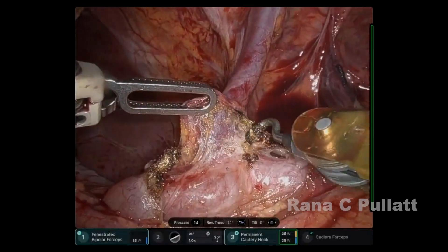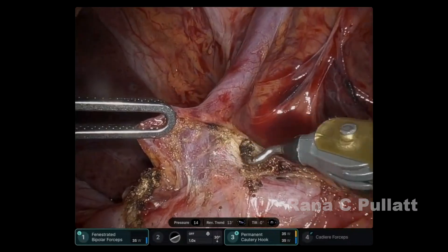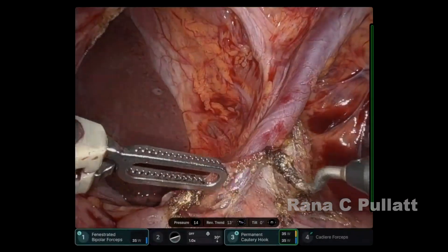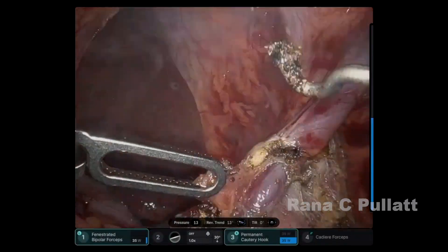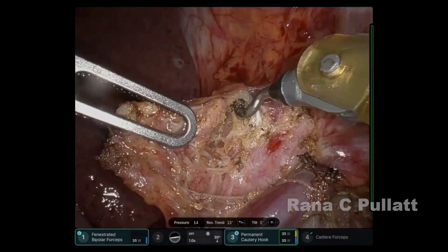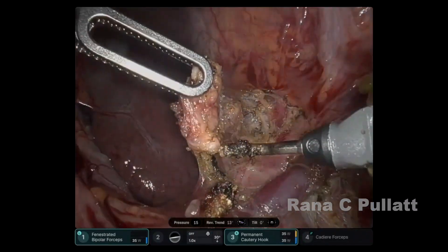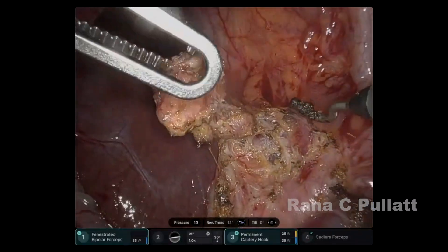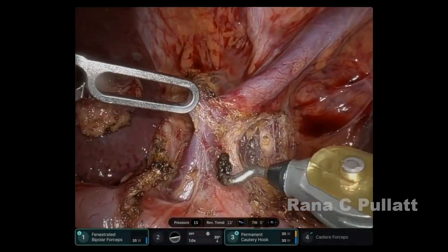The left gastric vein is identified and dissected. The left gastric artery and vein are usually preserved for this procedure. Occasionally the left gastric vein is ligated if it's in the way of dissection. In this case, the left gastric vein appeared to be wrapping around the artery, so we proceeded to divide it to facilitate better access to the left gastric artery and the celiac plexus.